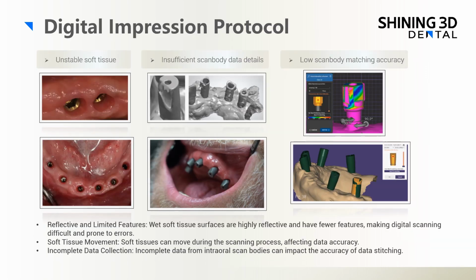The second workflow we introduce in this part is the digital impression workflow, which means we're using a common or regular intraoral scanner for full arch fixed restoration. Using an intraoral scanner for full arch fixed restoration data acquisition simplifies the conventional impression taking process and improves patient comfort. However, the downside is that the accuracy of implant positioning in digital impressions is not sufficiently accurate.